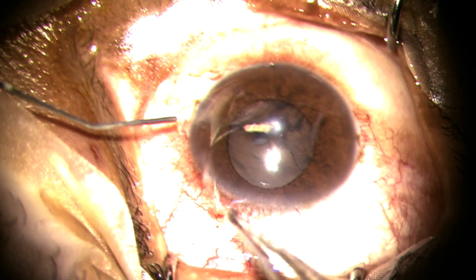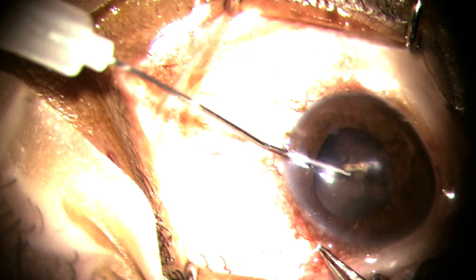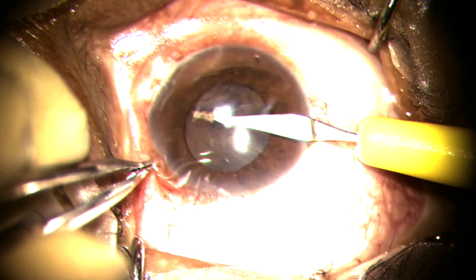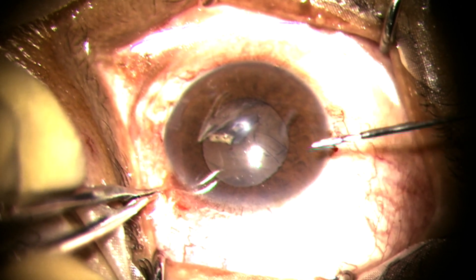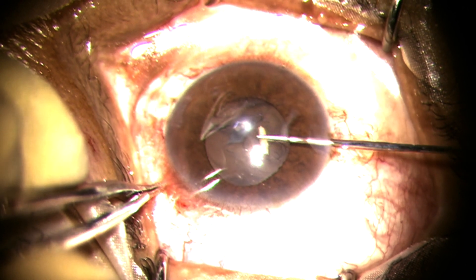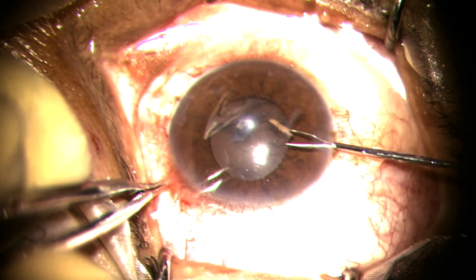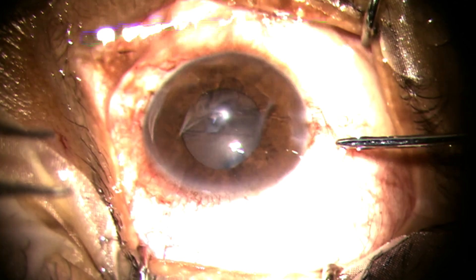The foreign body is now in the anterior chamber, so it is slightly easier to remove. A temporal side incision is made and the foreign body is removed with the help of microsurgical forceps. It is very easily pulled out of the eye.